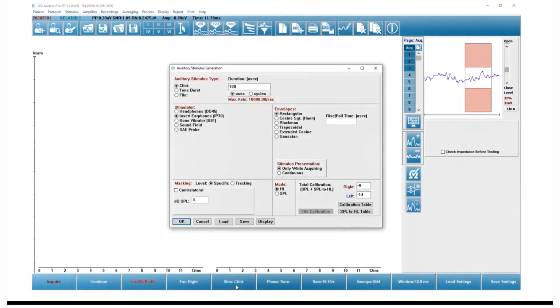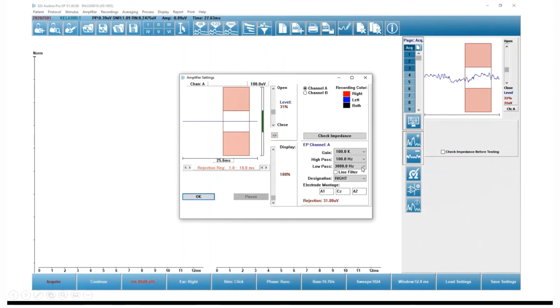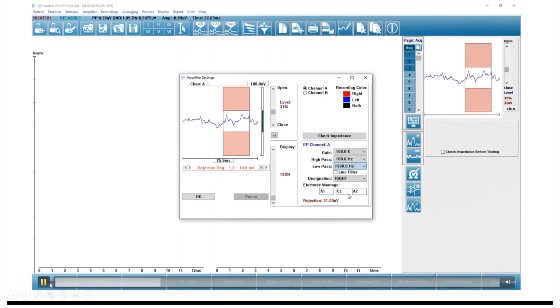If I select click, here you can see the headphone and the masking areas. Phase is rare. I'm going to change the rate to 19.7. I'm doing that because I know I have some electrical noise in my home office. And now what I want to do is check my amplifier settings. And I want to pause a moment here.